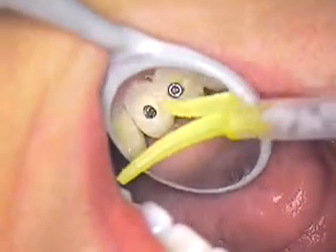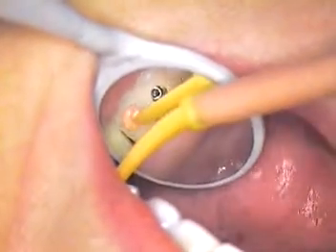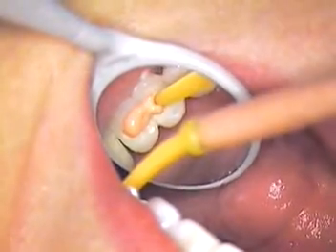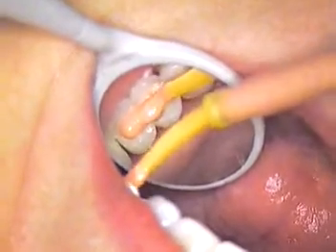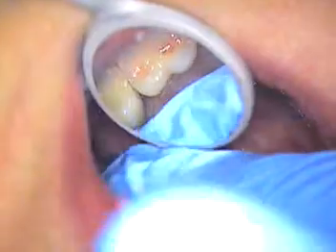So this is our VPS material. It's fast setting, it's going to go in. They're asking me how much time I'm going to need for my next appointment — that's a good question. I'm going to wipe this first and get that out of there. Got it out. I would say it's not going to be very long — probably a pre-block for what we need to do. Make it the end of the day.